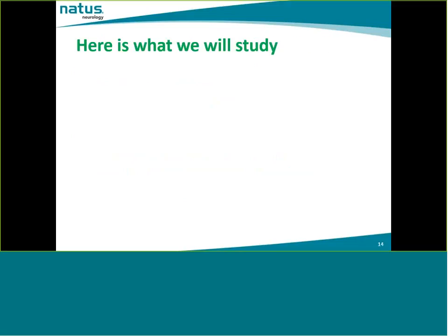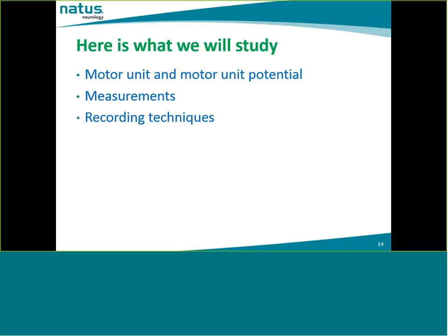Now that you have an idea about how multi-motor unit analysis has evolved since the 40s, here is what we are going to study in this seminar. I'm going to teach you some basic concepts of anatomy and physiology, the motor unit and motor unit potential. We will talk about measurements of motor unit potential. We will look at the different recording techniques, including the ones I have just mentioned. We will discuss how abnormalities are assessed.